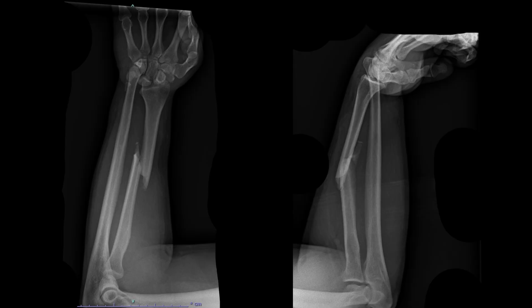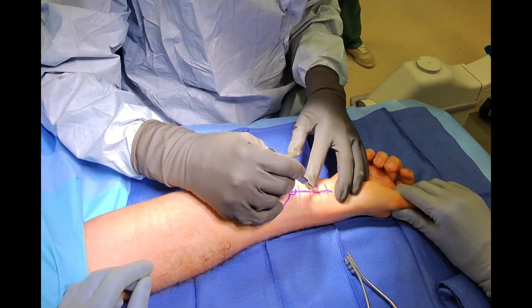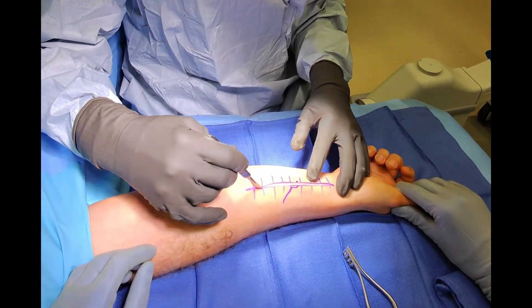Welcome to this instructional video demonstrating how to repair a radius fracture. We begin with an incision on the palmar side of the forearm.